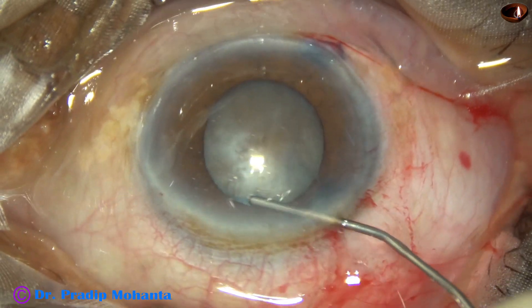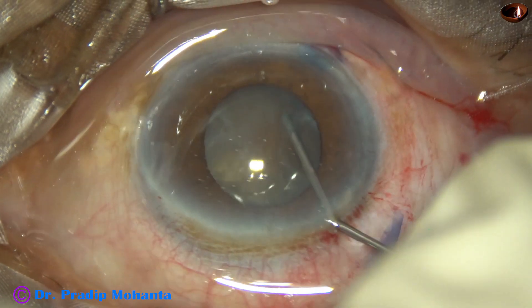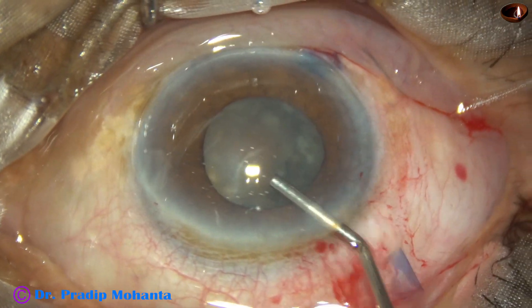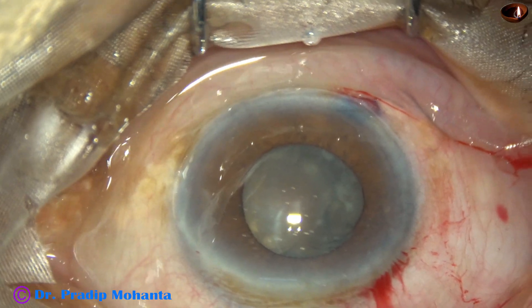In this case, as I started the rhexis and some viscoelastic came out, the pupil became small. So in this case, we should go a little beyond the pupillary margin to get a capsulorhexis of about 5 mm.